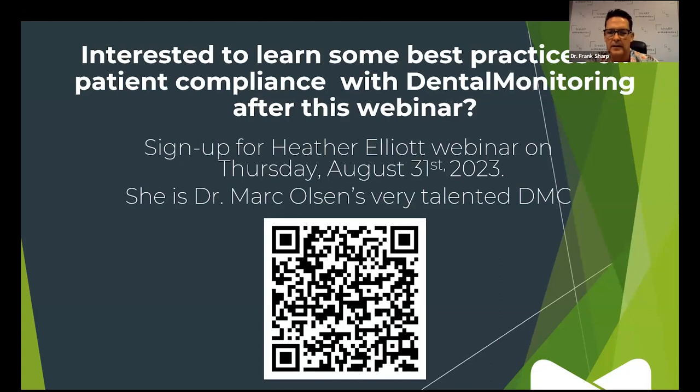I get up at the crack of dawn, so I usually go through the scans before I even get to the office. And then when Dr. Moore and I get here about 20 to 30 minutes before we start patients, we go through all of them. She goes through if there's anything we need to talk about as far as how treatment's going, some of the issues one patient may be having, some of the comments that they may send in. We get that all done in a 20 to 30 minute period, and we're looking at anywhere from probably 60 to over 100 scans, depending on how many come in that day. It's easy to take care of.